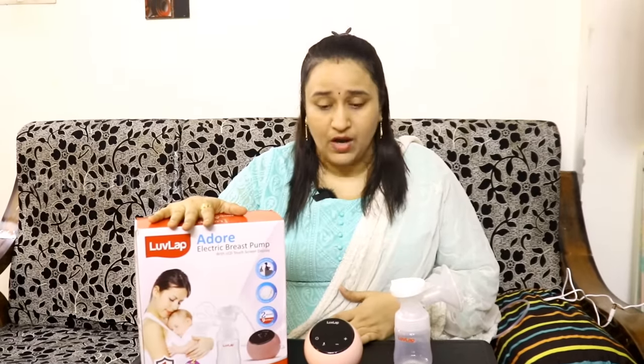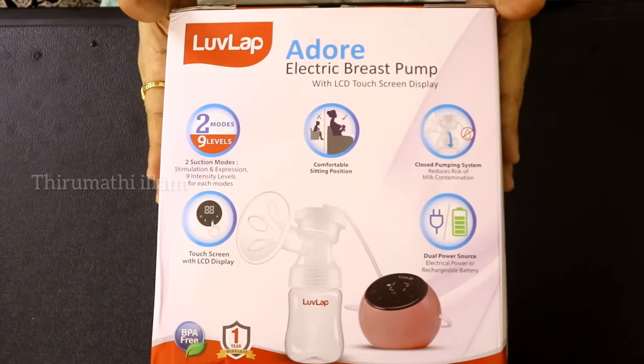There are attachments — how to assemble it and how to use it. This video covers a lot of useful information. If you have any questions about the breast pump, you can send a mail and I will reply. In this video, you can clear all your doubts. You can see the features of the Adore Electric Breast Pump.